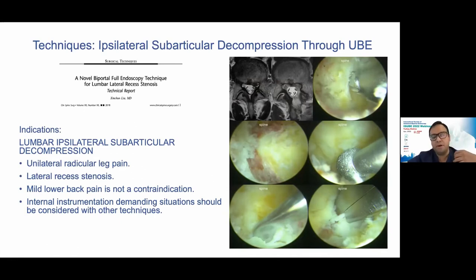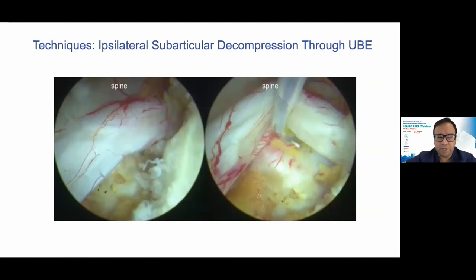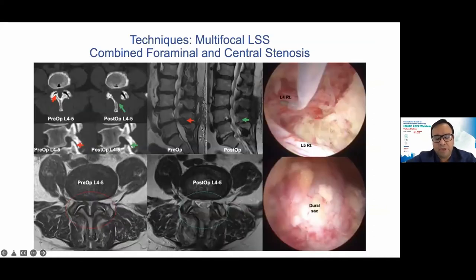Also, you have to take advantage of the angulation of your lens. You can rotate your lens, and even if you perform an ipsilateral approach, you can observe the contralateral view of your facet. And you can see here, for example, in a direct ipsilateral paramedian decompression, the traversing nerve. And also, you can reach more complex pathologies, for example, contralateral and foraminal decompression through a biportal technique.